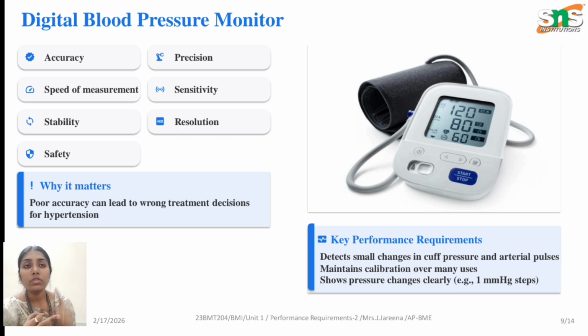And we also have to think about what constraints, limitations, or boundaries there are when we are designing. We have to work on that as well, because a medical device is not just a device; it is going to save the patient's life. It also has to be designed in such a way as to ensure patient safety and safe care of the patient. That is what a medical device is all about.